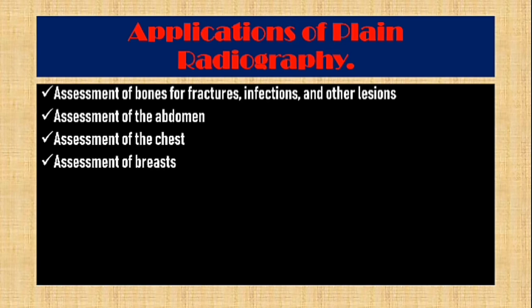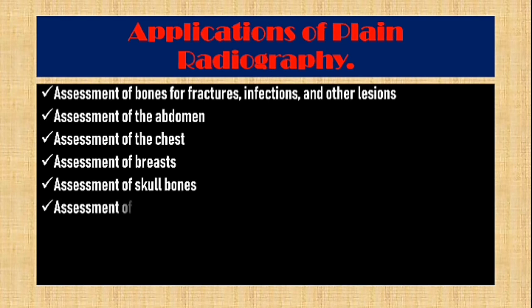It is also used in the assessment of breasts, especially for breast cancer. It is also used in the assessment of skull bones, for fractures, for abnormalities of the pituitary fossa, among others.